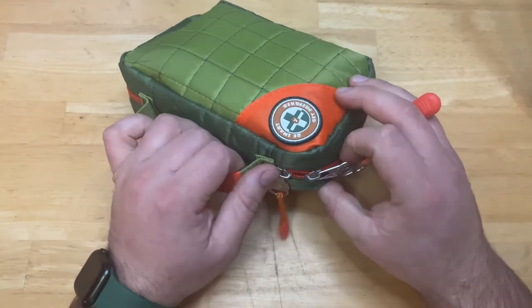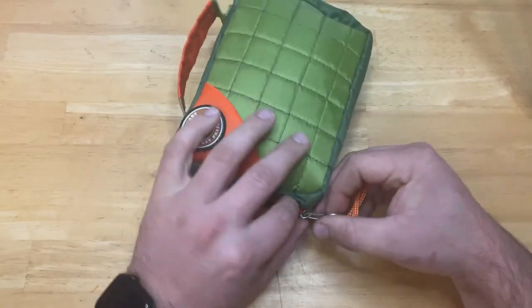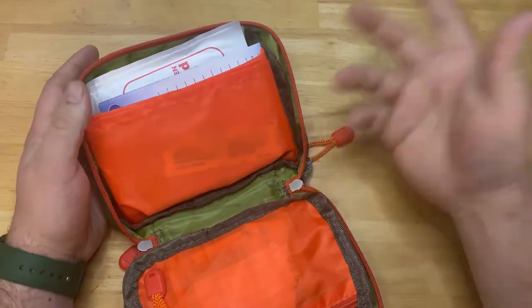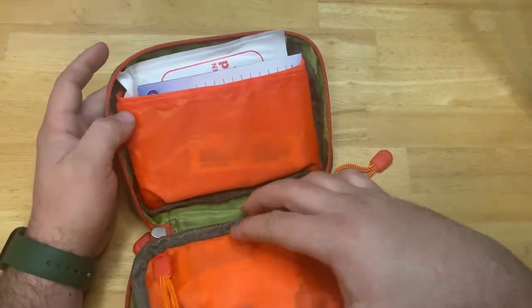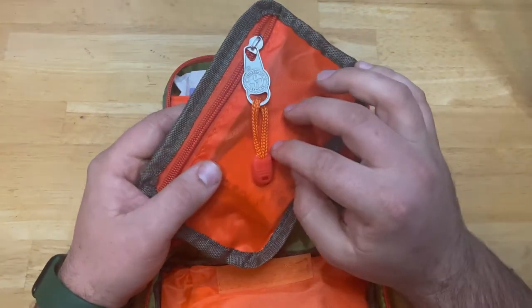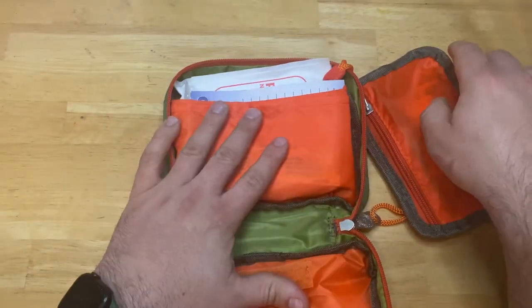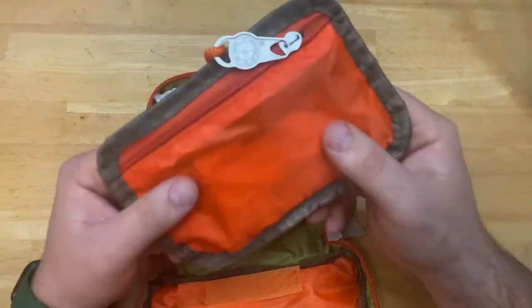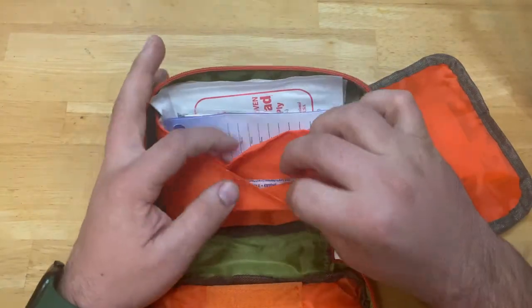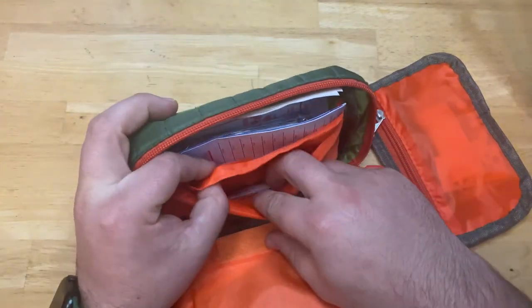Minus maybe a band-aid or so if my daughter got into it again. Let's open it up and see what we've got. When you open it up, it's actually not a bad kit — you've got a small tear-out layer here that you could throw certain stuff in and take with you. If you're going hiking for the day, grab this and leave the main kit at your base. There are a couple of band-aids in there.